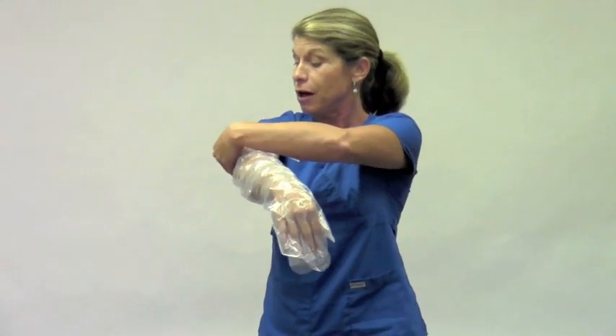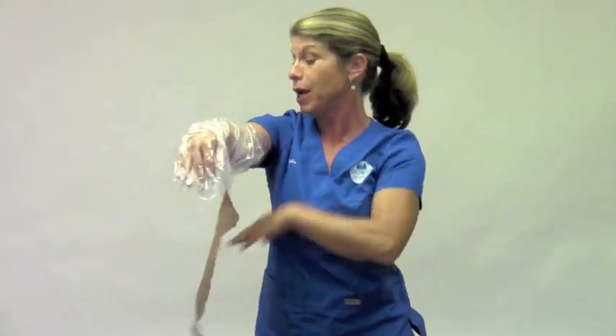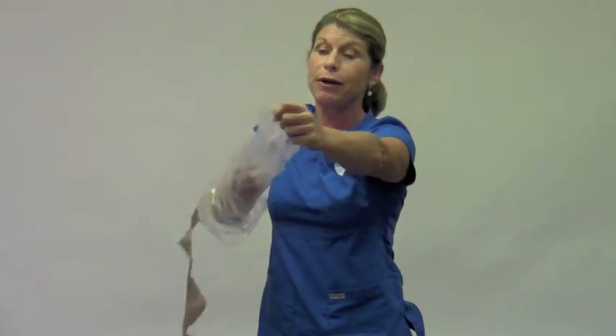When the patient is done showering, they towel dry the outside of the glove and do the wrap. The strap sticks to itself, not the skin, so it's not pulling any hair or ripping any skin. They pull it out and dispose of it in the garbage.